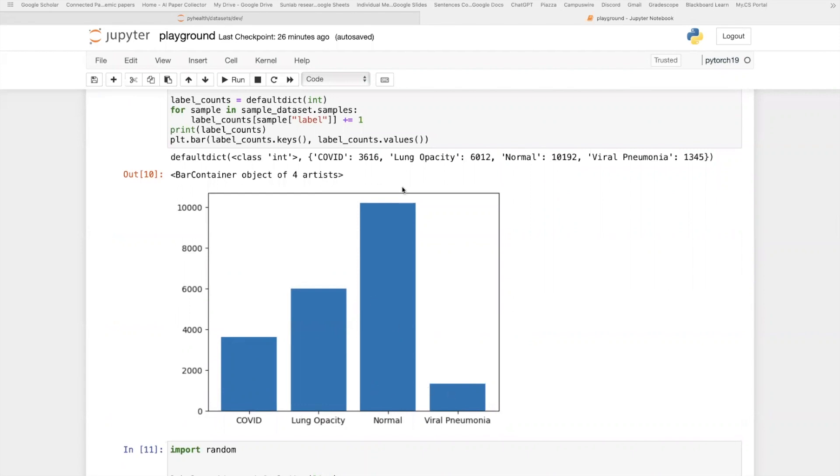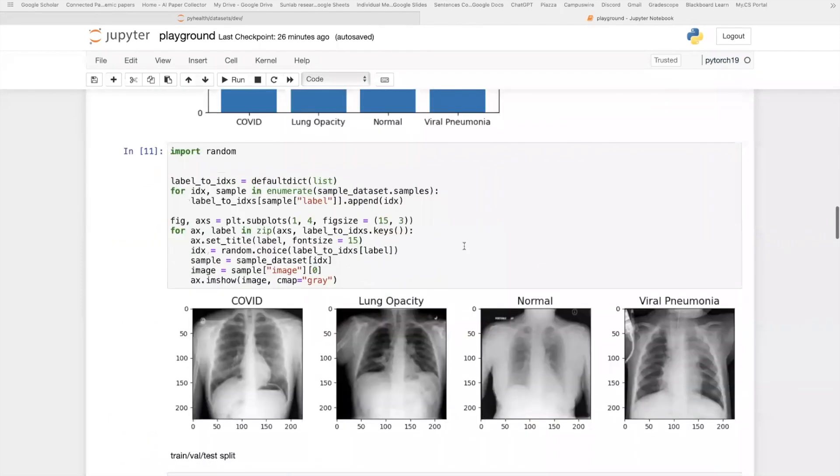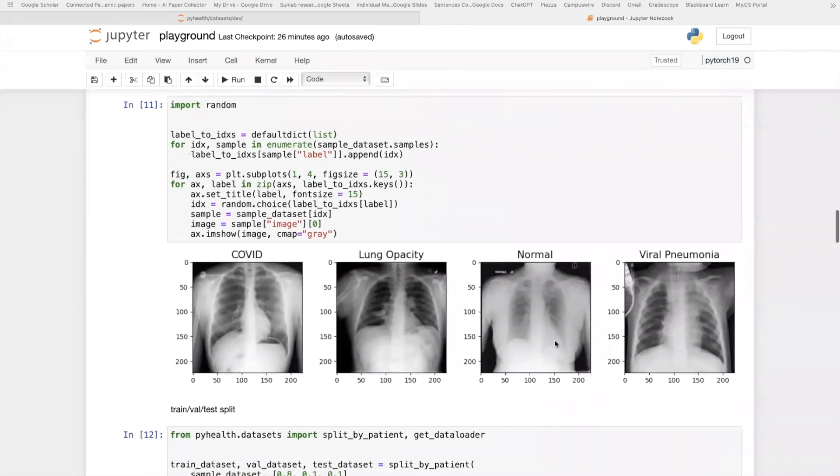Next, I show some data statistics in this dataset, the number of samples in each of the classes. As you can see, the normal class contains the most number of samples, while this viral pneumonia contains the least. And here, I plot one example image per class, as you can see here.